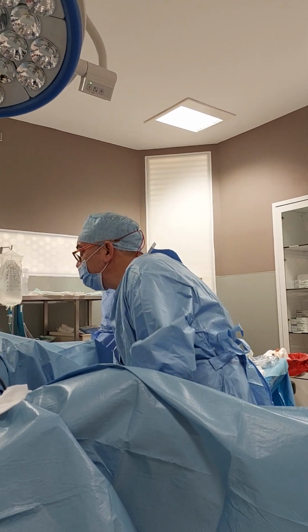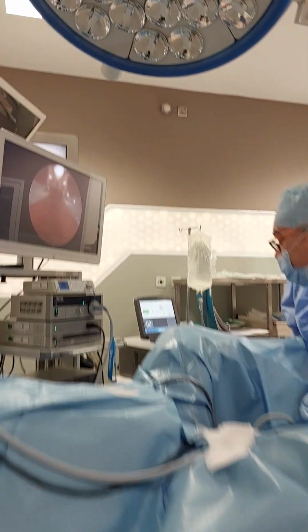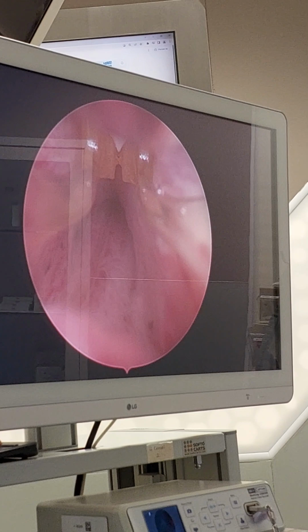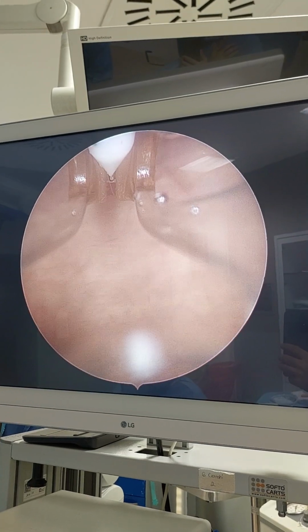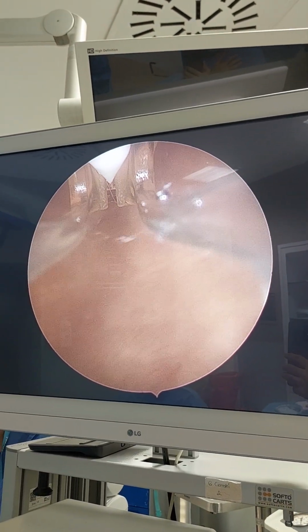I'm inside the bladder now. Yeah, bladder neck is not very tight. It's good. And oh, infection is coming out already. So I will do the prostate massage first. It has more than normal residual urine. Look at this yellowish color inside. This means residual urine. And I am doing the cystoscopy right now.